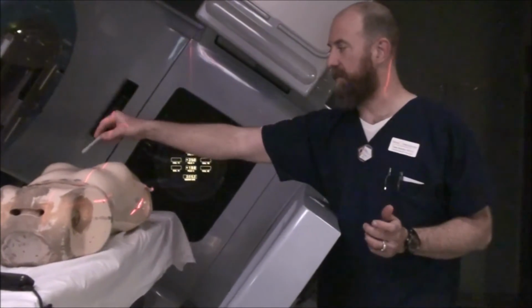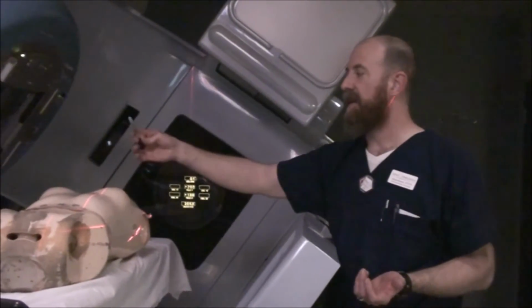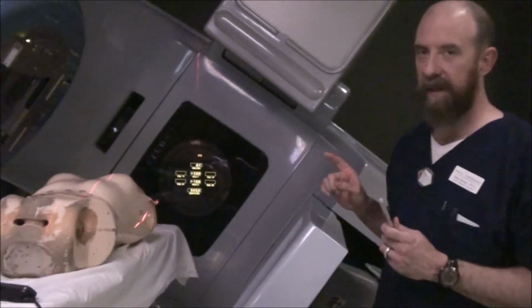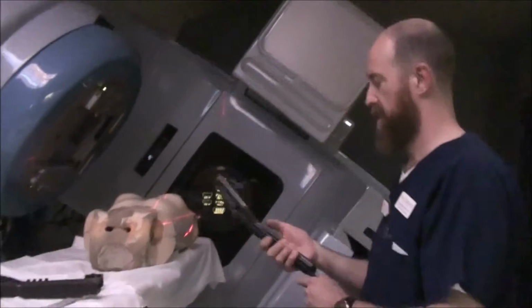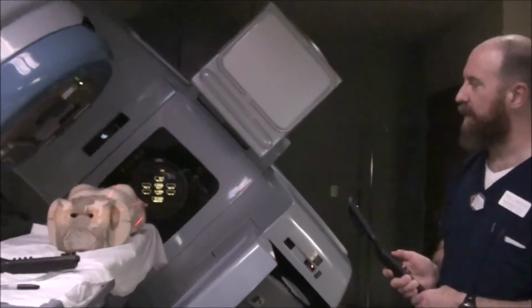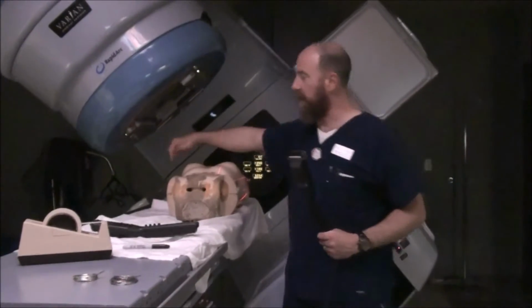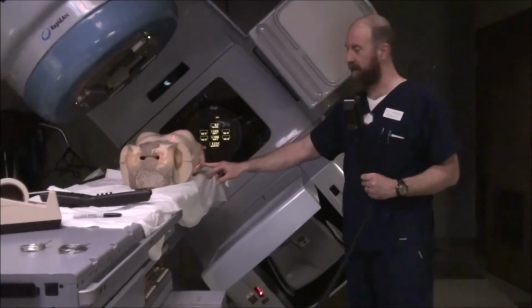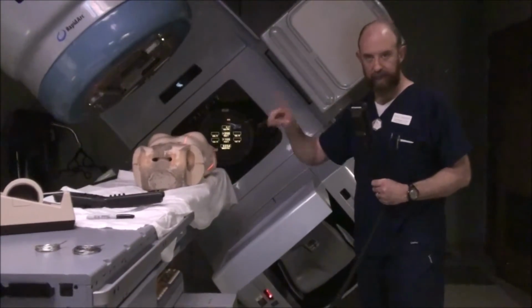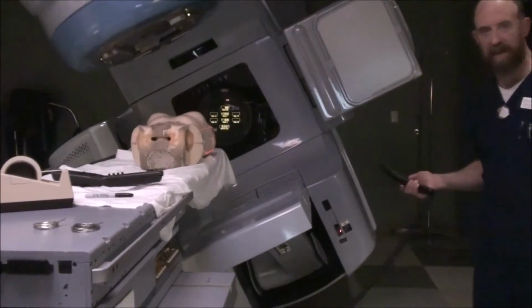Some would like you to mark everything, some will just do a little bit of superior, a little bit of inferior, some will just mark a CR. Either way, you're going to rotate your gantry. Once you rotate up a little bit, you're going to see the opposite side. You're normally going to have both arms up. Go ahead and give yourself a lateral mark on this side. Now you've got a 3-point setup, because we already have a dot over here that we were going to with this wire. Either way, rotate around to the equal and opposite gantry angle.